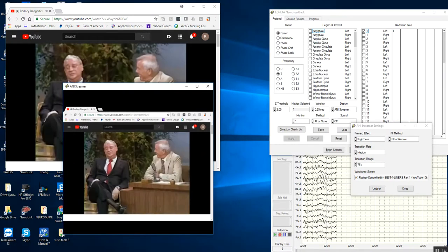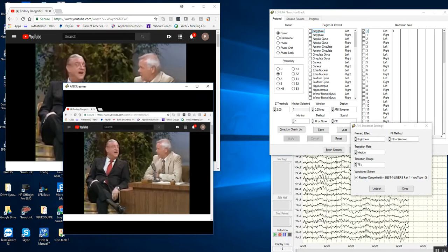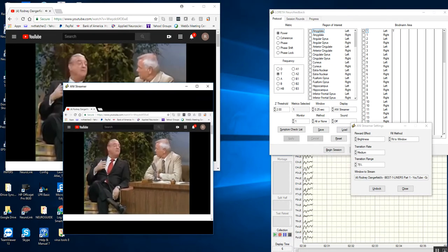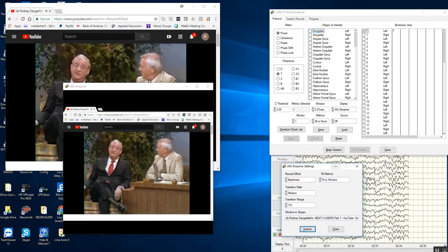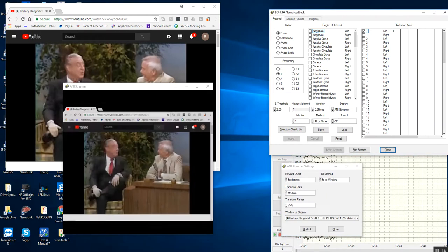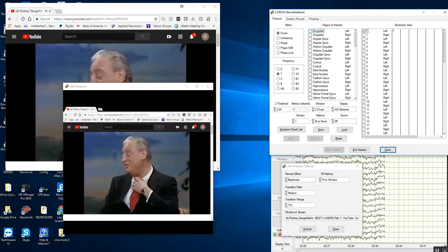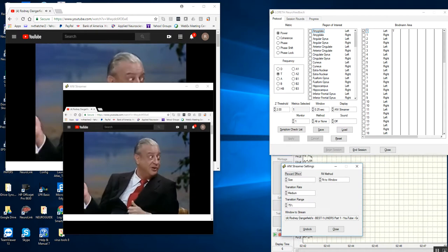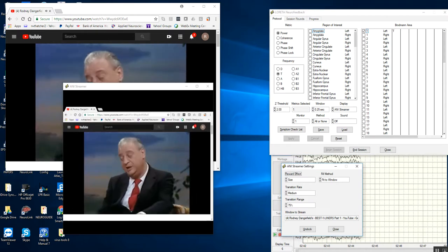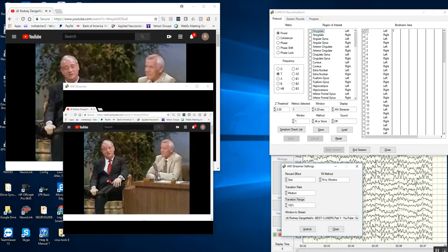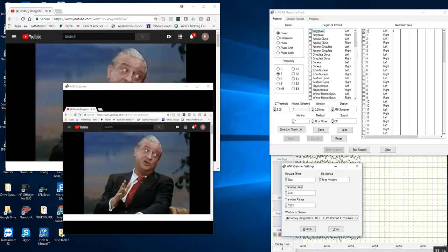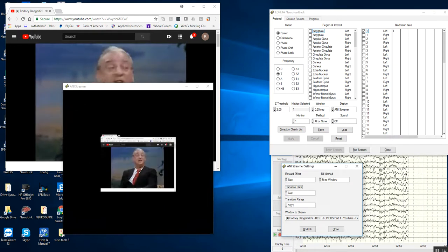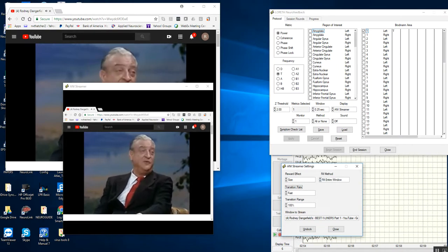We can resize it and do various things. Now I'm going to begin the session so you can see the kinds of changes. We can unlock it or lock it. Right now, it's a brightness effect. I can change it so it's size. It's a 75% change, but I can go to 100%. The rate of change is medium. I can make it fast, so it changes very quickly. You can fit to the window, or you can stretch it out.